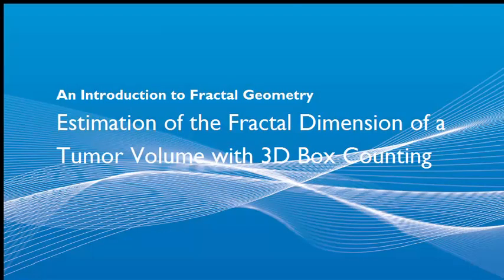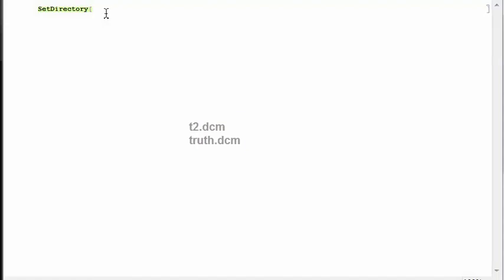In this section we are going to implement 3D box counting to measure the fractality of a tumor volume. We start by downloading the datasets t2.dcm and truth.dcm and placing them in the same folder where we have created this notebook.